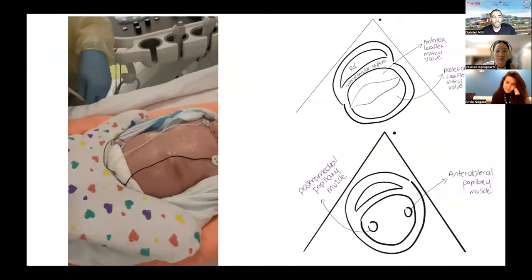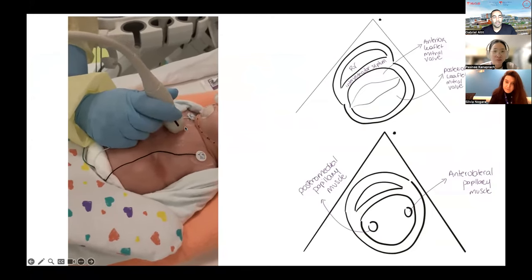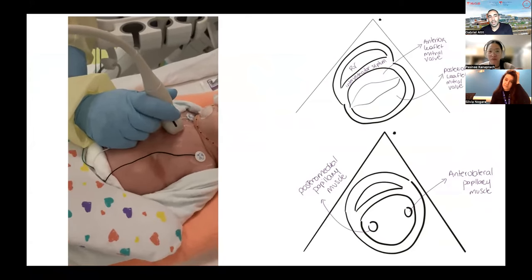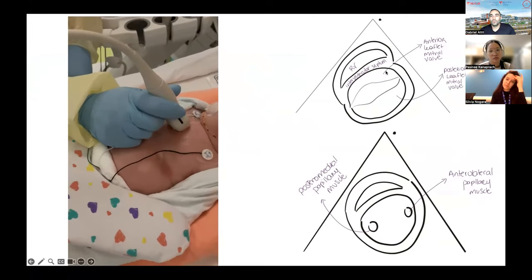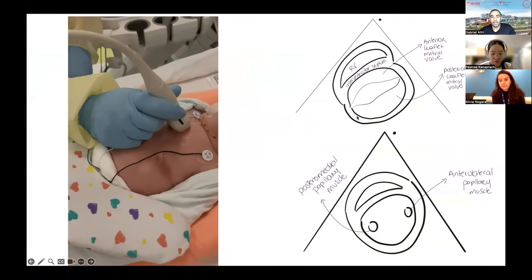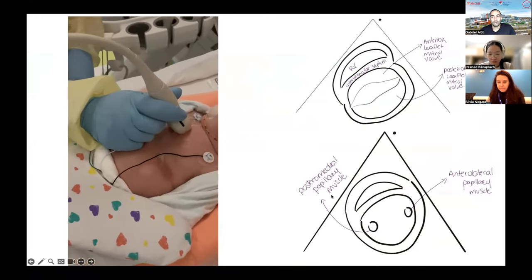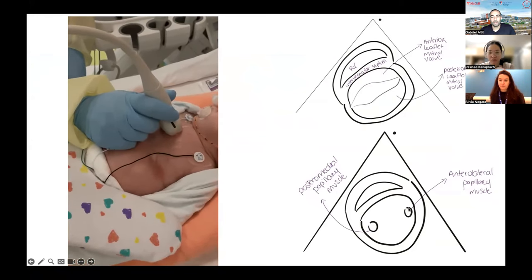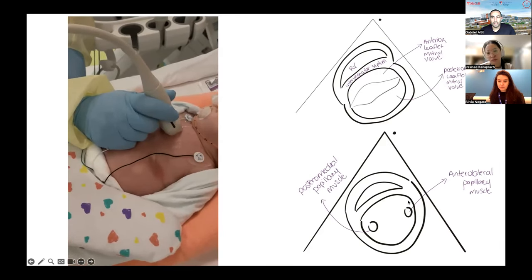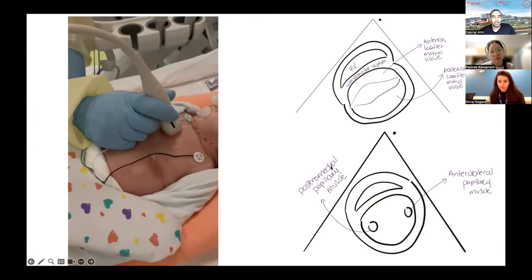Okay, parasternal short axis view. Here you can see we're doing a 90 degree turn from the parasternal long axis. In this view, we're going to go from the aortic valve up to the apex and get different cuts. You'll see now the whole anterior leaflet and the whole posterior leaflet of the mitral valve. And you're going to see the two papillary muscles typically, the anterior lateral papillary muscle, which is lateral and anterior, and the other one, which is more posterior and more medial, so we call it the posterior medial.